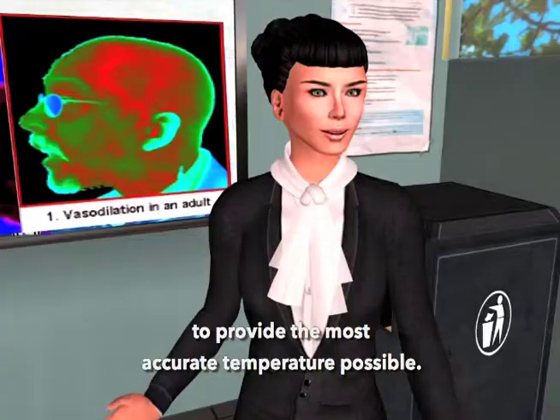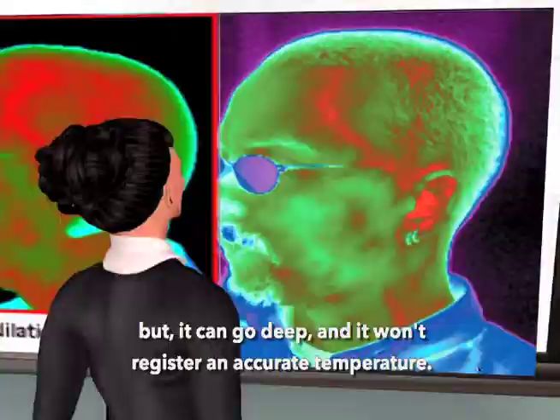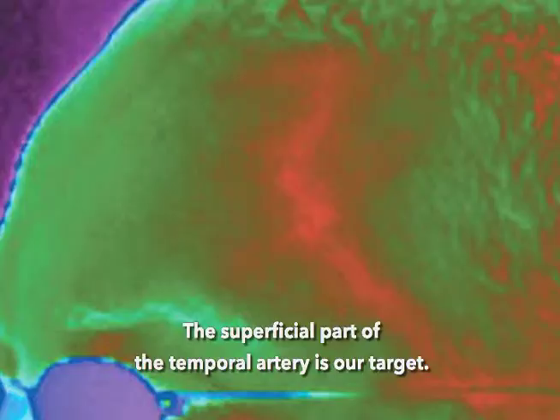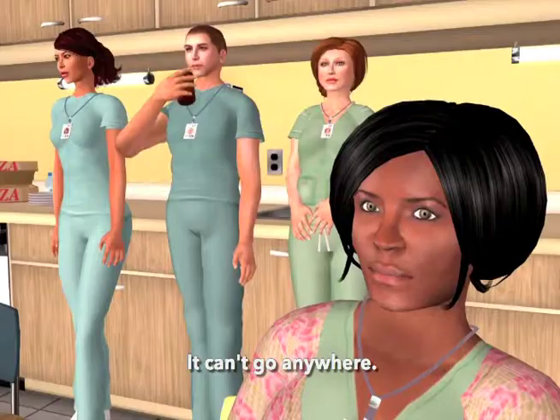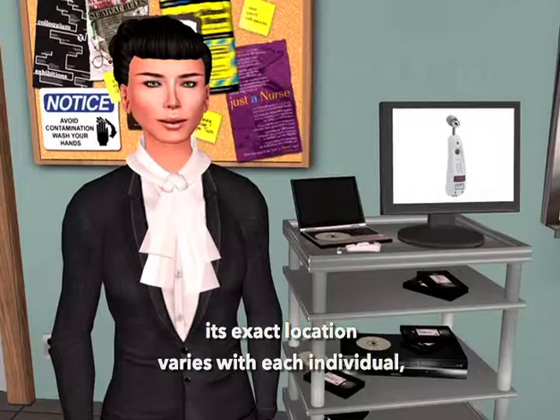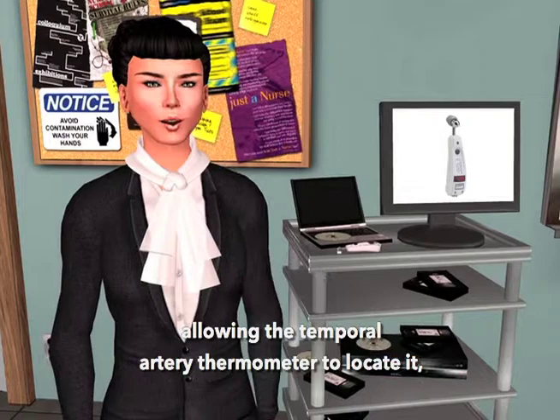The temporal artery comes up from the side of the face from the external carotids, but it can go deep and won't register an accurate temperature. The superficial part of the temporal artery is our target, located up in the forehead, about two millimeters below the skin, literally trapped between the skin and the skull — it can't go anywhere. Its exact location varies with each individual, which is why we scan, allowing the temporal artery thermometer to locate it, something like a radar detector.